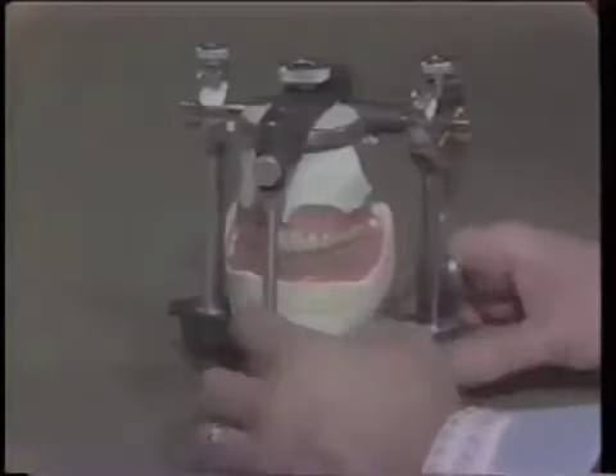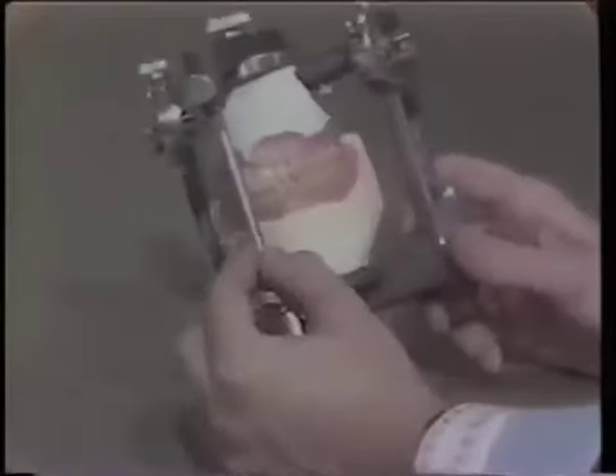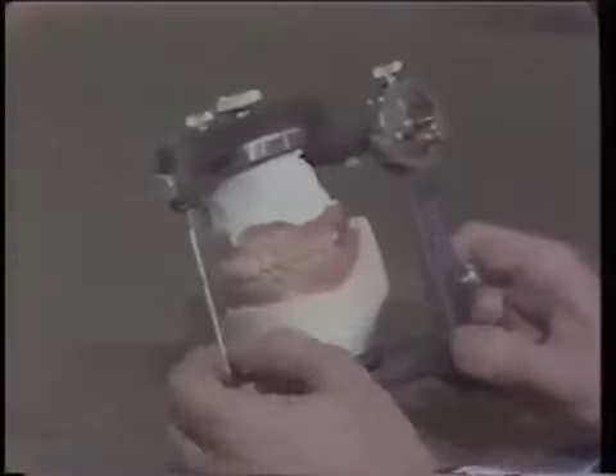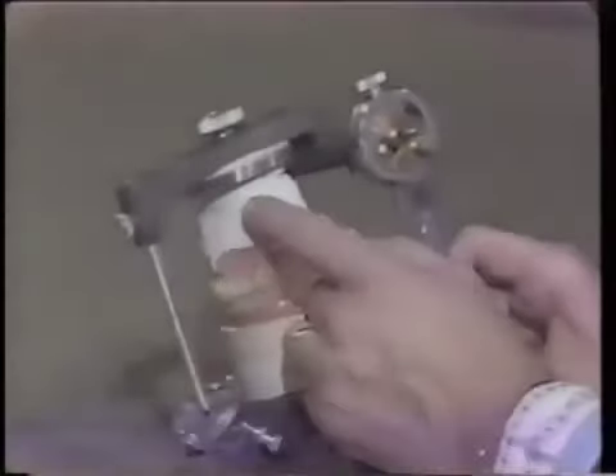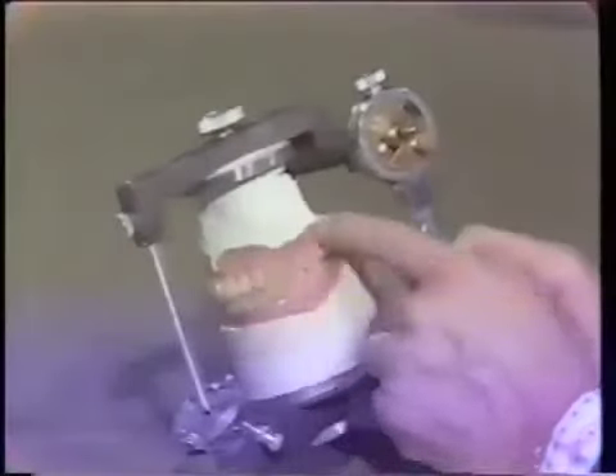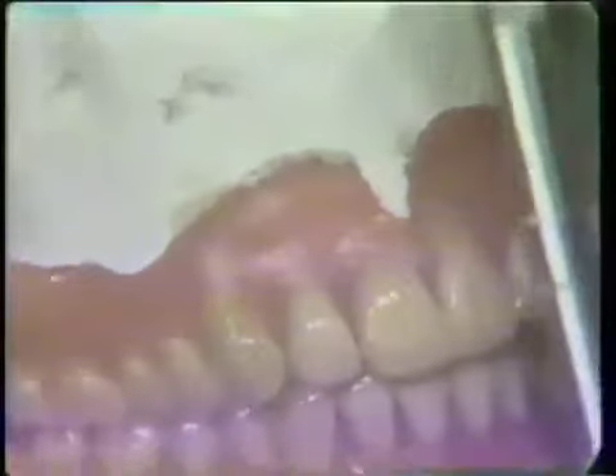At this time, the case is ready to begin our selective grinding, refinement of the occlusion. We have added a little more plaster to make sure you have enough for strength. You'll notice that the borders are free — we haven't embedded the borders of the denture in the plaster. You can see a little bit of the asbestos that we've used for block out in the anterior portion.